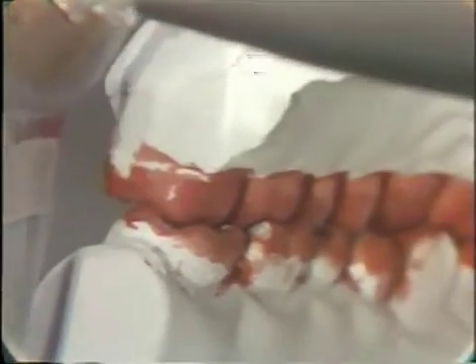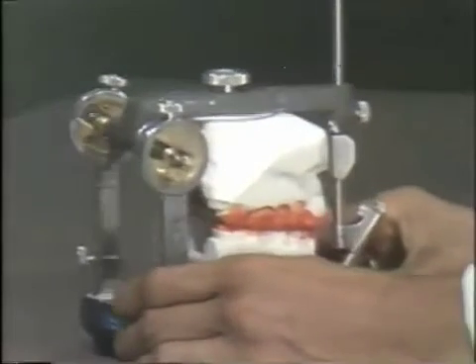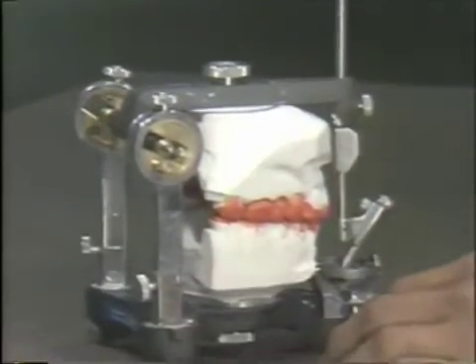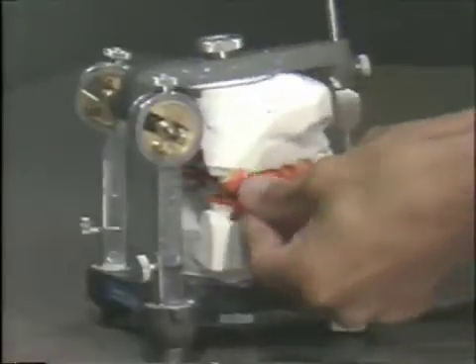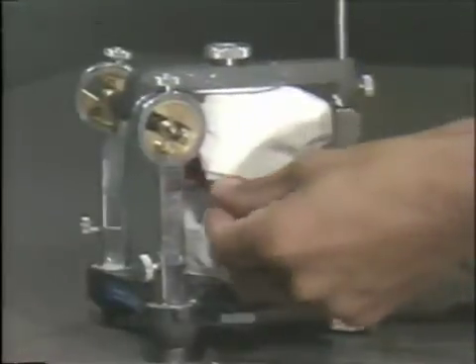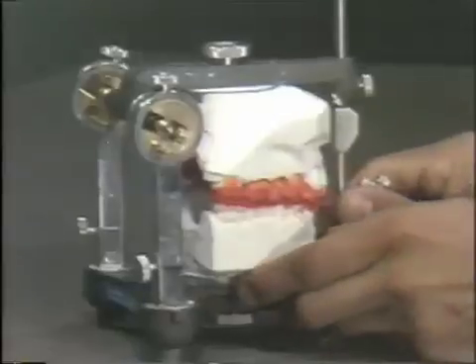Right here on this tip is where I fall over, and there's a clunk right there. Then at this point I'm past it on the first molar, but the second molar is still maintaining contact — the two supporting cusps are together. So what we would do is go back and take the articulating paper, articulating ribbon, and place it in between the teeth, then go into excursion from the centric occlusion position with the shims in.